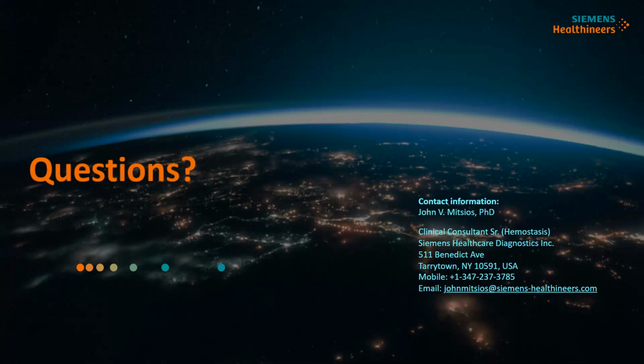In one of the papers that I recently read, which looked at, I believe, NASCOLA proficiency testing results, they were leaning towards recommending 0.6, which is a more robust way of assessing the activity to antigen ratio. I think hopefully when the guidelines are reanalyzed and more studies have been done, we'll have a more ideal ratio, now also that we have this Innovance activity assay on the market here in the US.